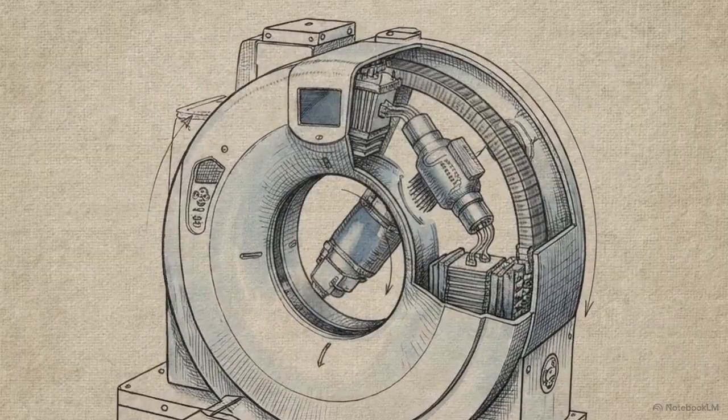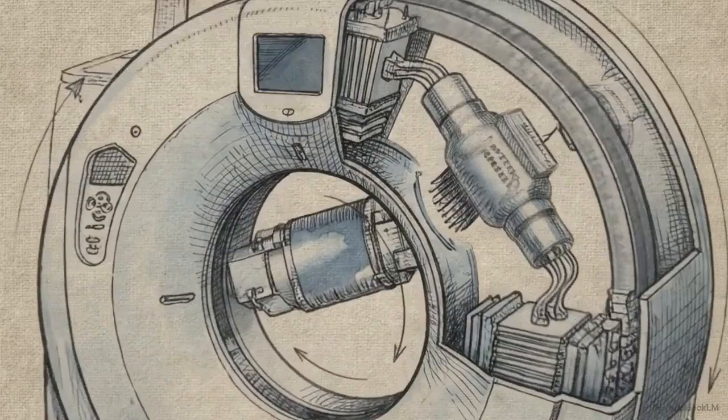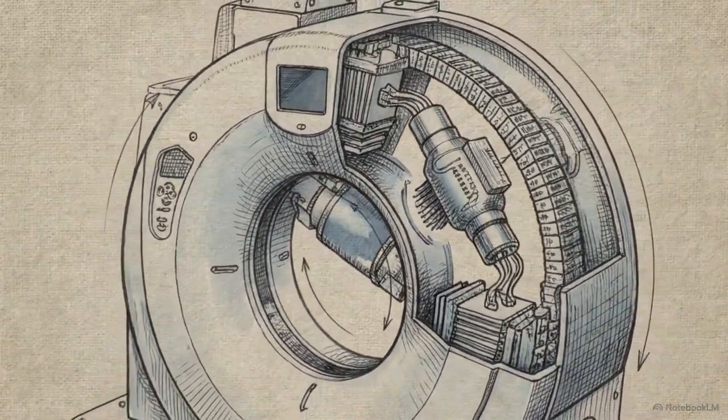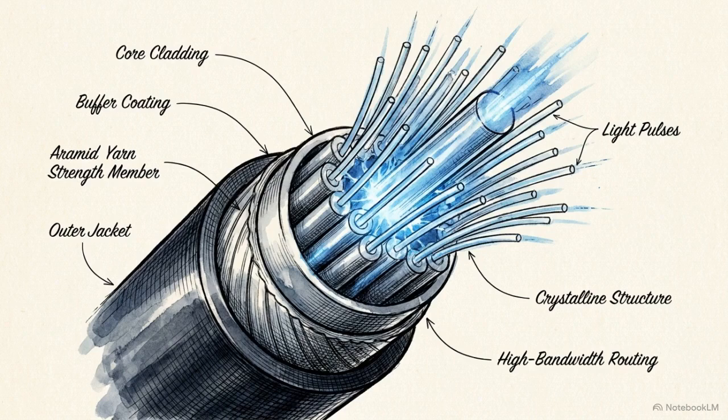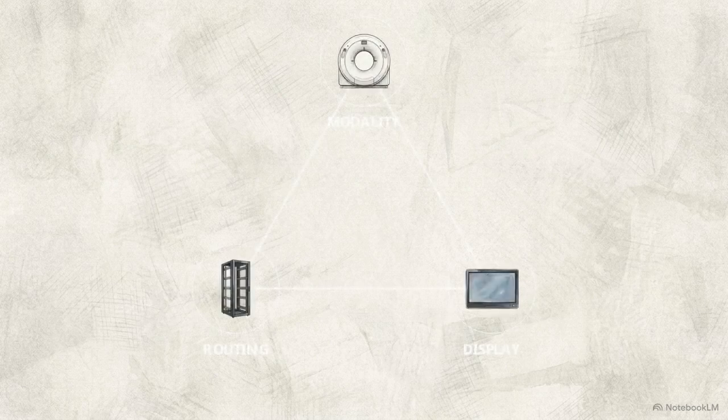The life cycle of a clinical image is highly structured and deeply interdependent. It begins with the mechanical precision and daily quality assurance of the physical scanners. It relies on high-bandwidth fiber optic routing and complex hardware translation to reach the legacy hospital archive. And it concludes on a mathematically precise, DICOM-compliant diagnostic monitor that actively fights its own physical degradation. A failure at any single point in this triad instantly compromises the validity of the entire system.